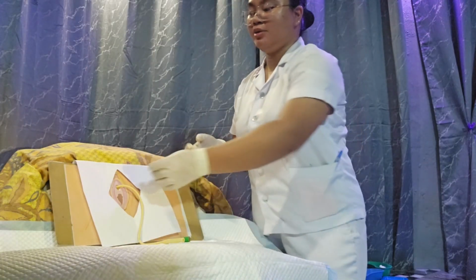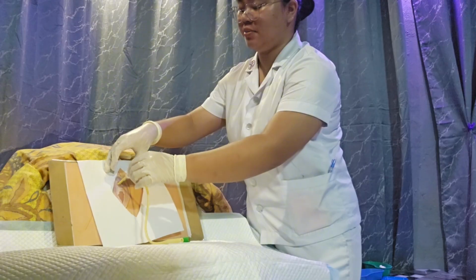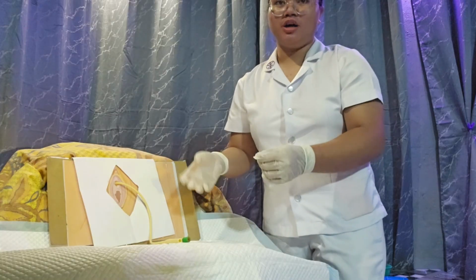To ensure that we inflate the balloon properly, we're going to check that it doesn't slip out of the patient's meatus.